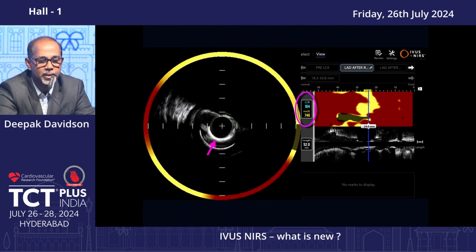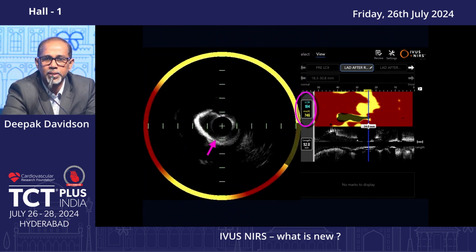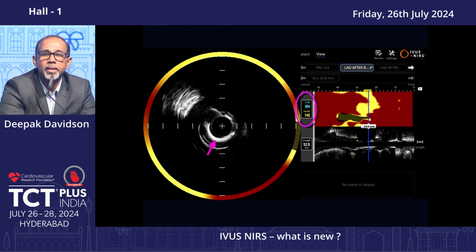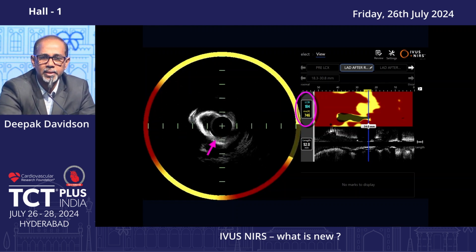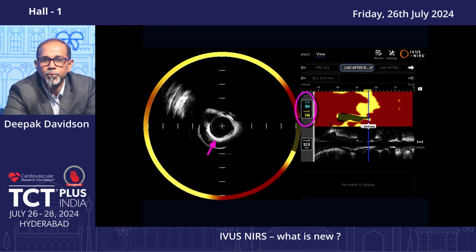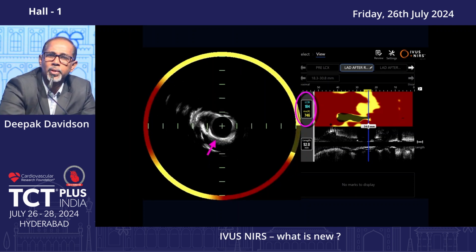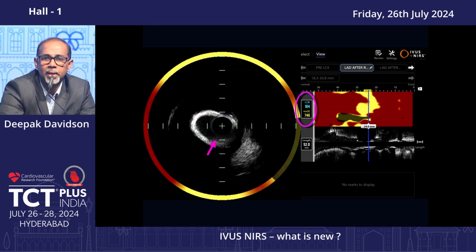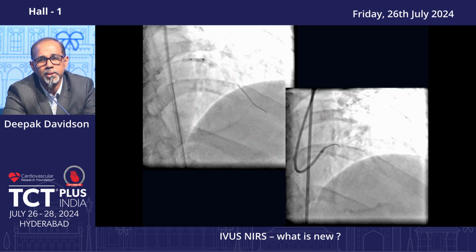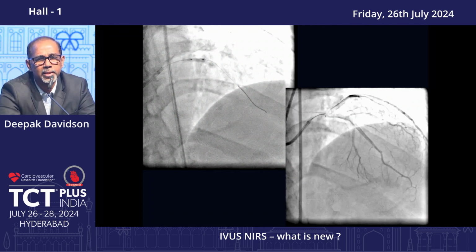It was very interesting. You could see that there is a 360-degree arc of calcification. However, at that particular area of calcification, you could see that there is a huge amount of lipid pool, which makes us understand that you needn't be very aggressive at that particular area. If you're very aggressive with post-dilatation, you're likely to embolize distally. Second thing is, when you have a huge amount of lipid, probably the calcium is not very thick. You don't have to be very aggressive while doing the pre-dilatation and post-dilatation.